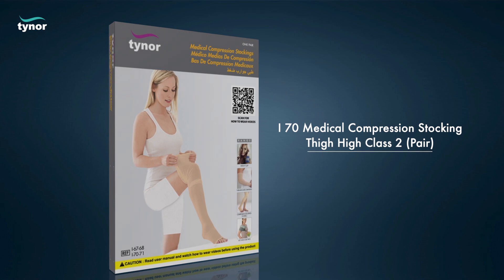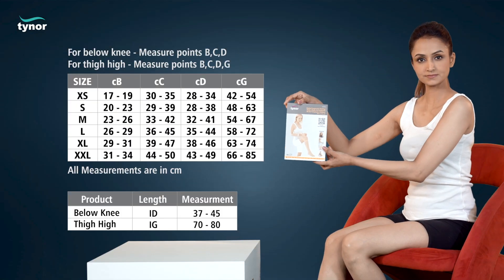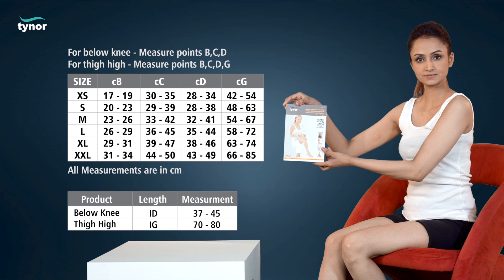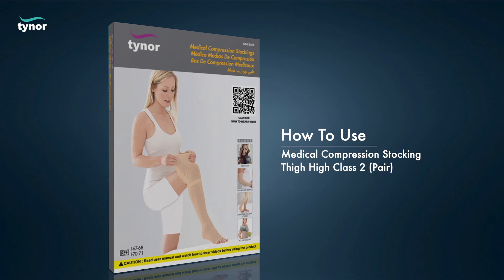Here we will discuss how to measure the size and how to use the medical compression stocking thigh-high class 2. This stocking comes in various sizes. Now let us see how to use the medical compression stocking thigh-high class 2.